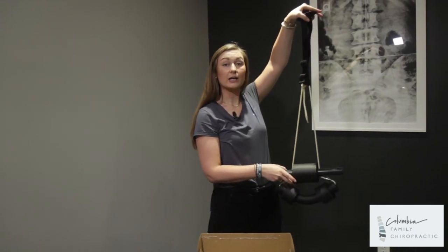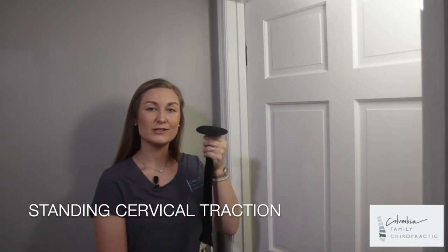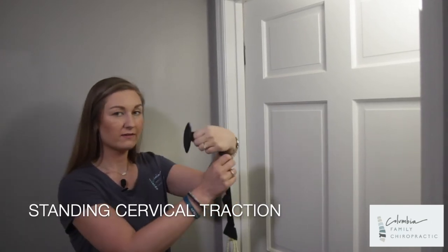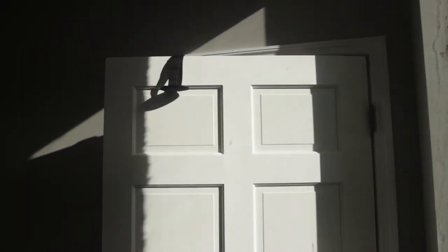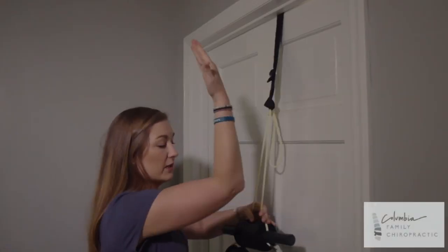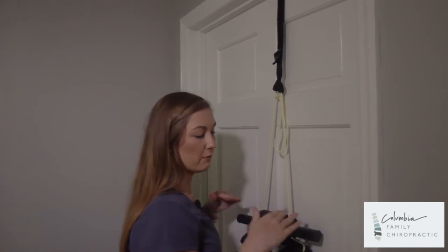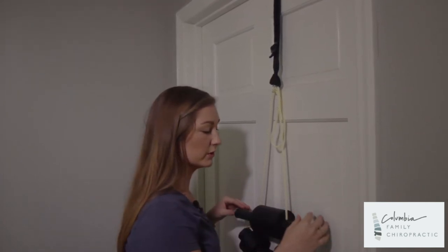Next, let's go ahead and look at it over the door. I'm going to show you how to use this on the door. You will take the whole unit and make sure that this goes over the door. Go ahead and close it, and then I want you to make sure to give it a good tug so that it flushes up against the wall. As you'll see, what we like is for this bar to be about the same height as our shoulders.